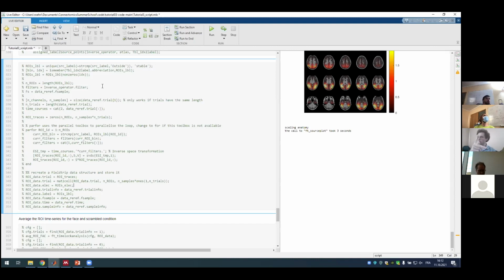The second reason is that even if you find the same subspace, the SVD has a sign ambiguity. So basically you can have one thing, so the X, let's say here, could change its sign and become something like this. And then it means that between the trials, it will swap the sign, and again, it doesn't make any sense to do it like that. So really, you want to have one subspace for the whole recording.